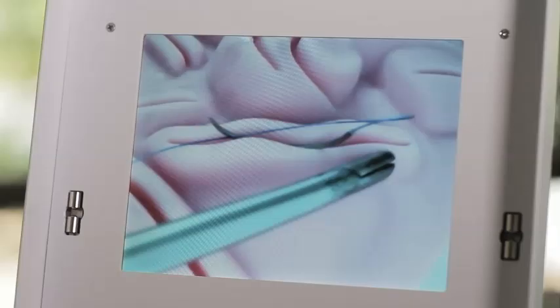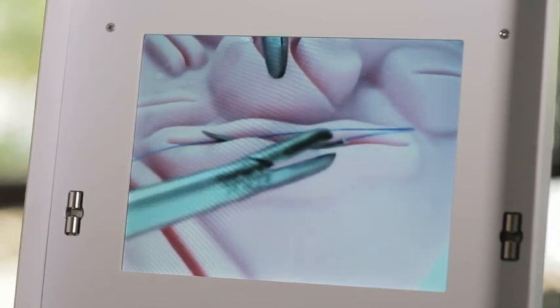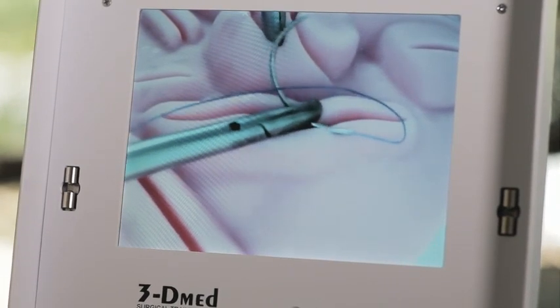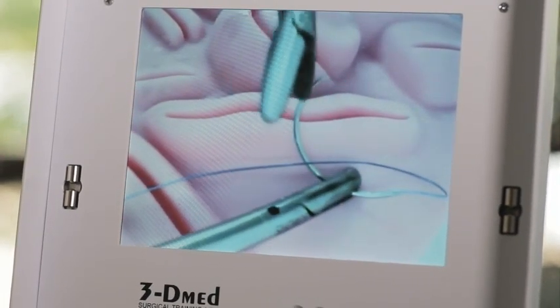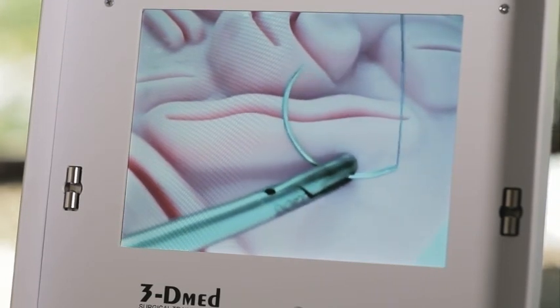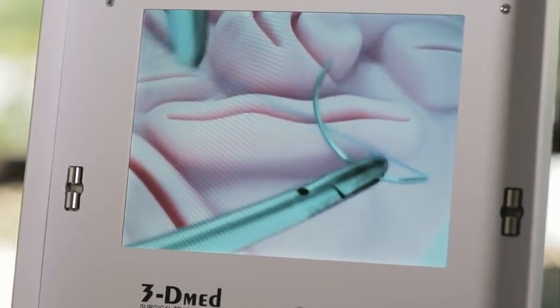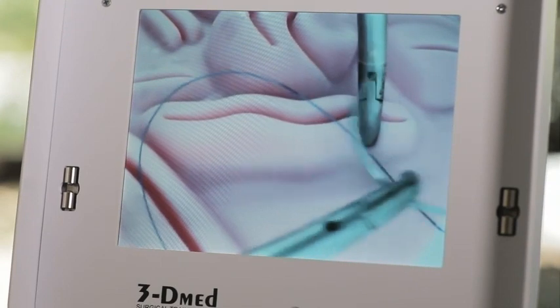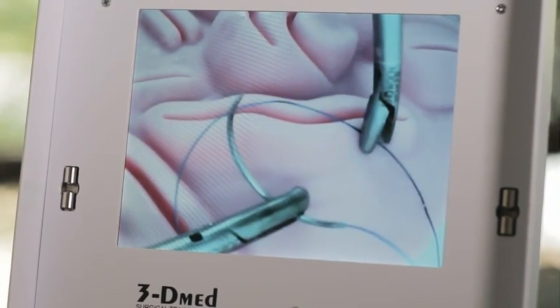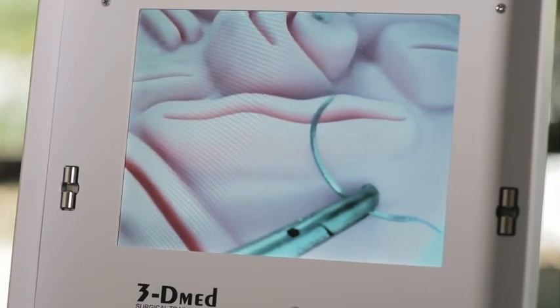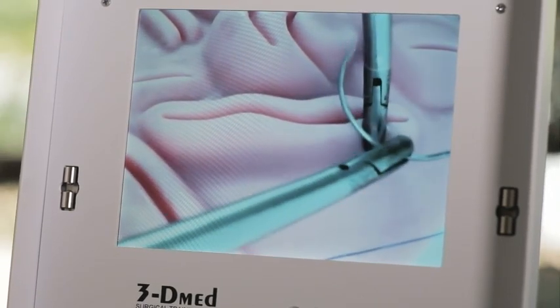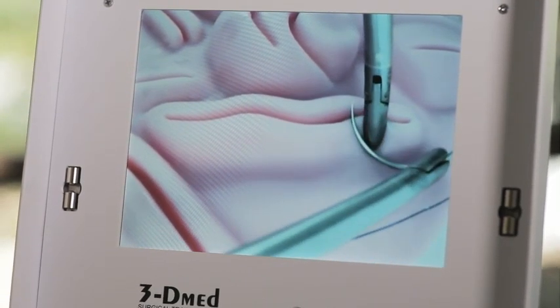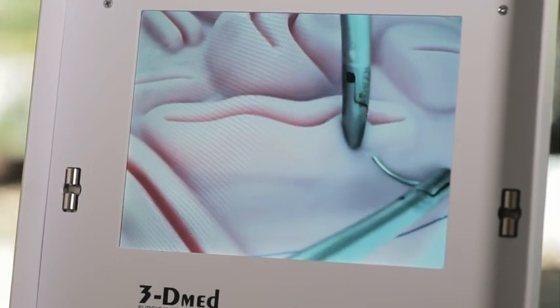We're going to pick up the suture and close this pseudo vagina. I'm going to reach for the needle and push it into the tissue which helps me to orient it in a right angle. I'm going to pick up the edge of the vagina to overcome the lack of three dimensionality. I will simply use the side of my needle to show me when I have touched the tissue.